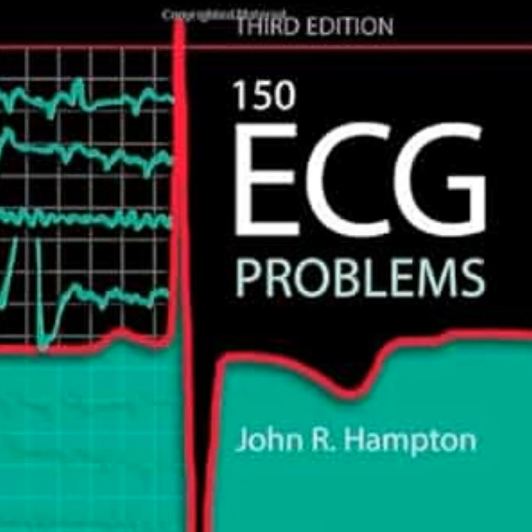And the answer is you have to step away from the electrical data entirely and gather anatomical data. Okay. You order an echocardiogram. Right, the ultrasound. Yeah.